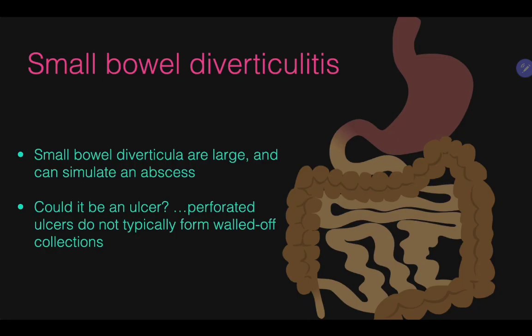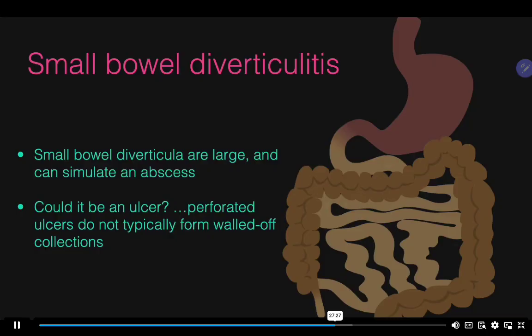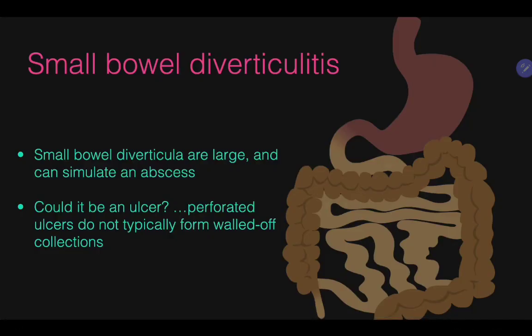really exciting. We're going to talk about small bowel diverticulitis. And I really enjoy making this diagnosis, and it can be a bit mind-blowing when you first encounter it. Please remember that these diverticula are usually quite large and much larger than their colonic diverticular counterparts. And second, while there may be a temptation to wonder about the possibility of a perforated ulcer, remember that ulcers, when they perforate, do not typically form nicely walled off collections.